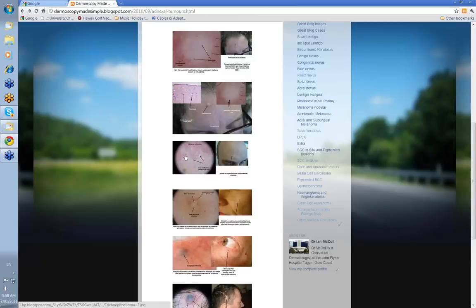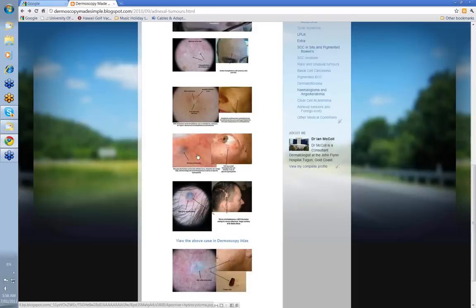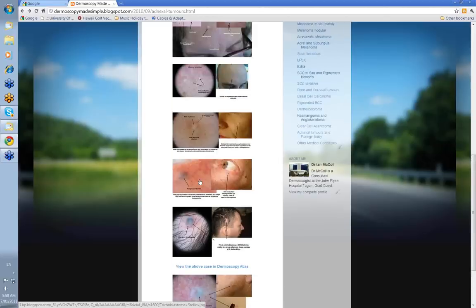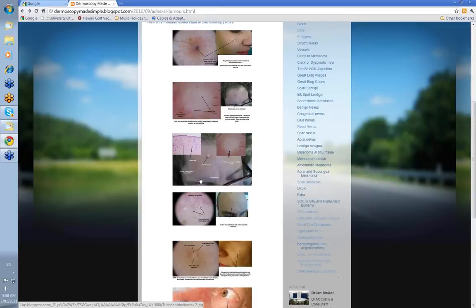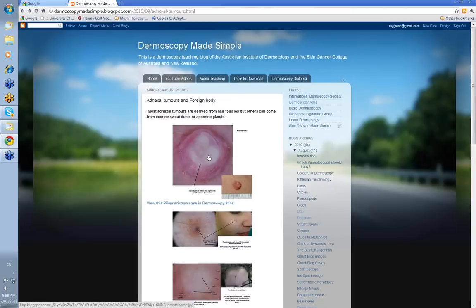That's just a quick romp through some adnexal tumours. The pilomatrixoma, the trichoepithelioma, the apocrine hydrocystoma, the trichoblastoma — these are the things you're going to see. Remember foreign bodies as a cause of blue-white or blue-grey structureless, and remember the milia that you're going to see in the trichoepithelioma. There will be other adnexal tumours to add later. That's all we're going to cover today. Thank you very much.